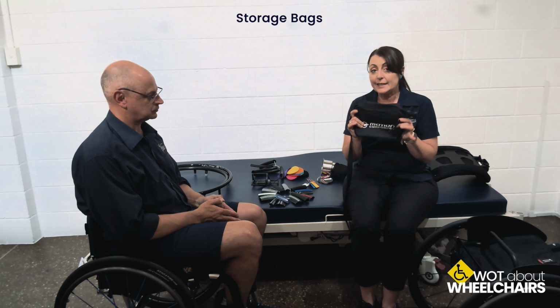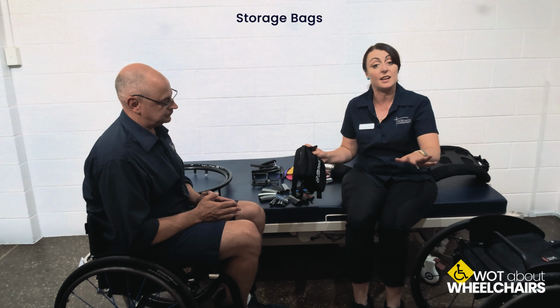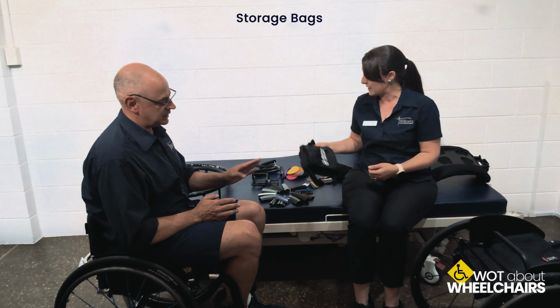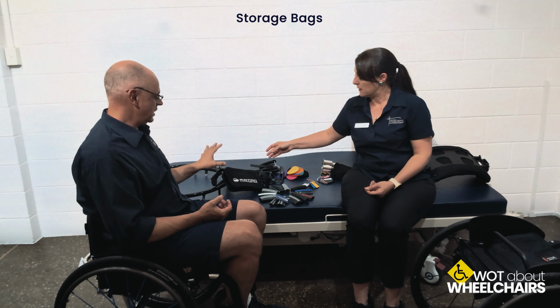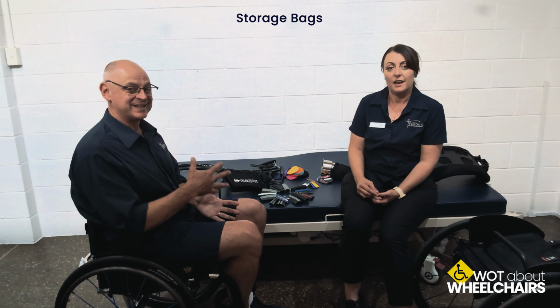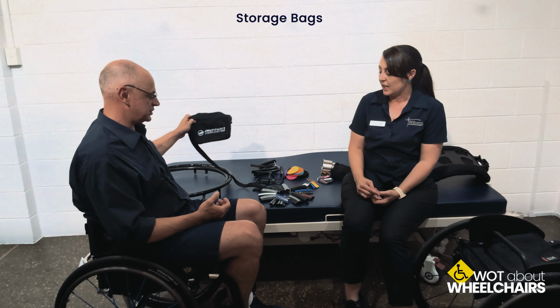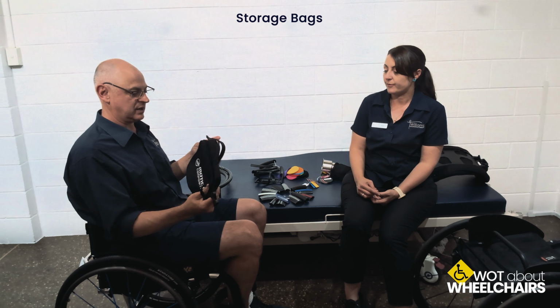So there are little bags that you can get that fasten underneath the front of the seat. This goes across the frame hangers, so that it's literally between your legs and you can unzip it, pop your valuables in there, and they're nice and secure and easy to access. Now I noticed in our cushion video, and if you haven't gone back and looked at the cushion video, make sure you do, one of our cushions even had a compartment attached to the cushion itself, rather than this one. But this one can be taken off and into the shop with you.